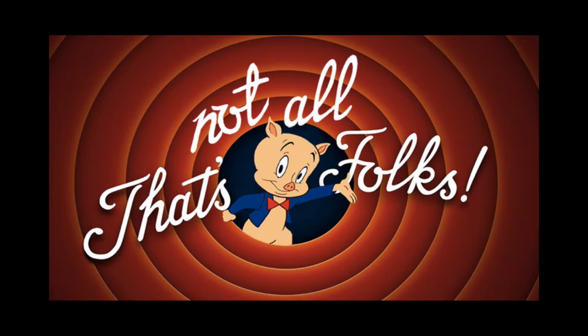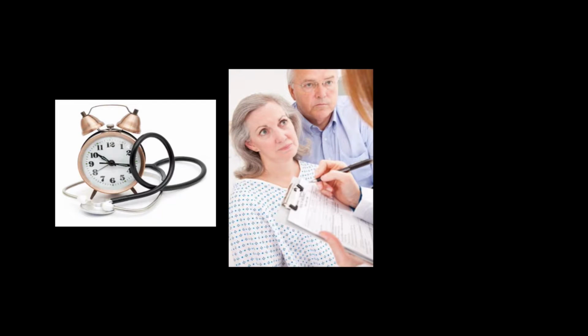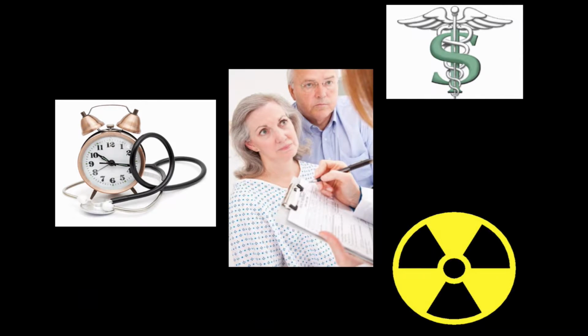But that's not all. It's not just about sensitivity. The patient is the center of care. What matters? Time. It takes less than 5 minutes to do a 4D-CT study, but 2 to 3 hours to complete a sestamibi scintigraphy study because of the delayed imaging. Then there's the costs, important to both patients and payers, as well as the radiation exposure.